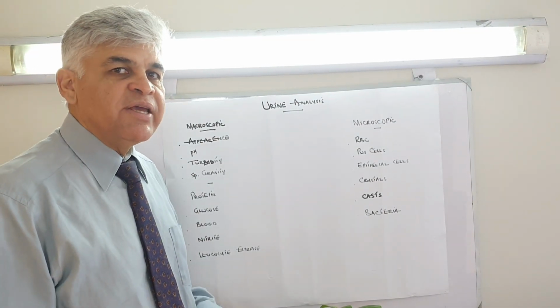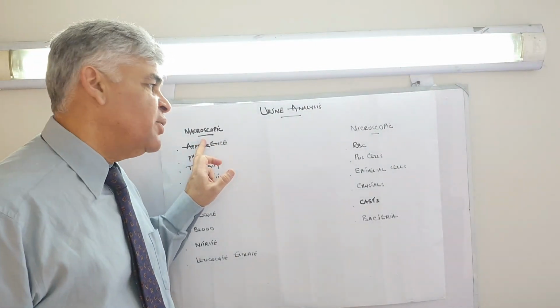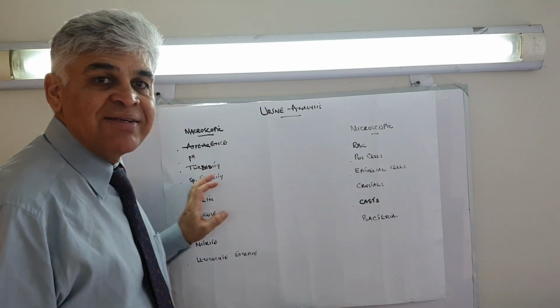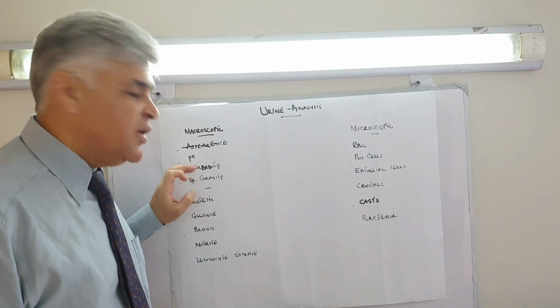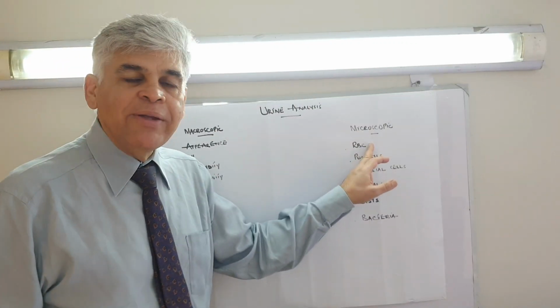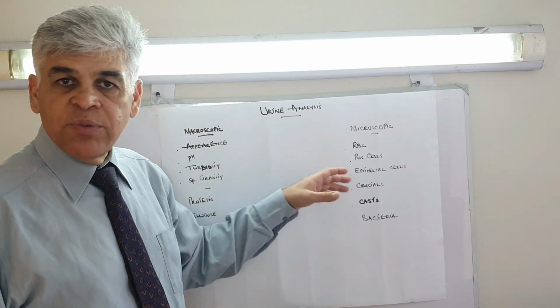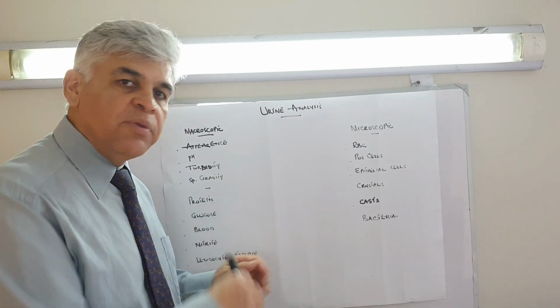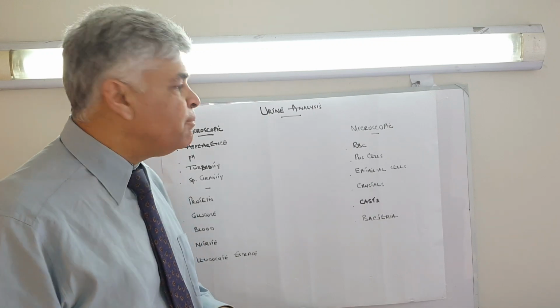Whenever you see a urine report, you'll see two kinds of headings. One of them is the macroscopic appearance of the urine, and the other one is the microscopic appearance. It often has the same variables. That means in macroscopic, we'll get appearance, pH, turbidity, proteins, glucose, blood, and leukocyte esterase. But the microscopic one is done to confirm what is present in the macroscopic appearance. That's when you look at the RBCs, you look at the pus cells, and thereby you confirm what is thought to be present macroscopically.